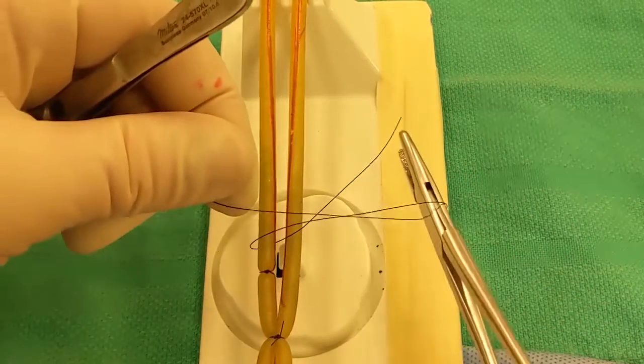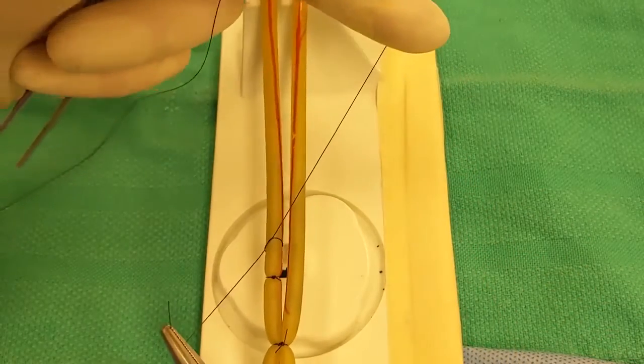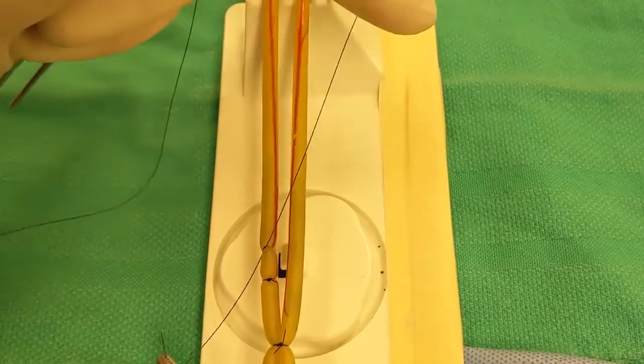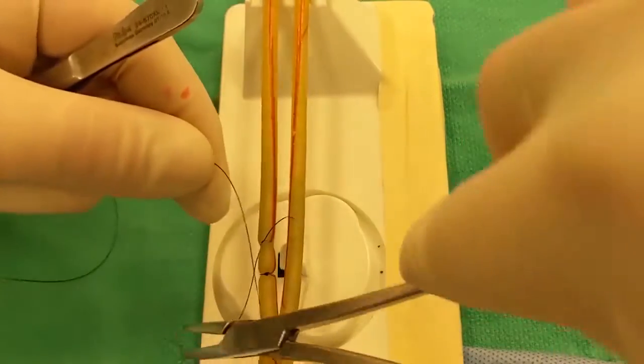So we'll throw a regular square knot here, two throws. And there's a couple different ways to do transfixations, but we're teaching you to throw a full square knot on this side.